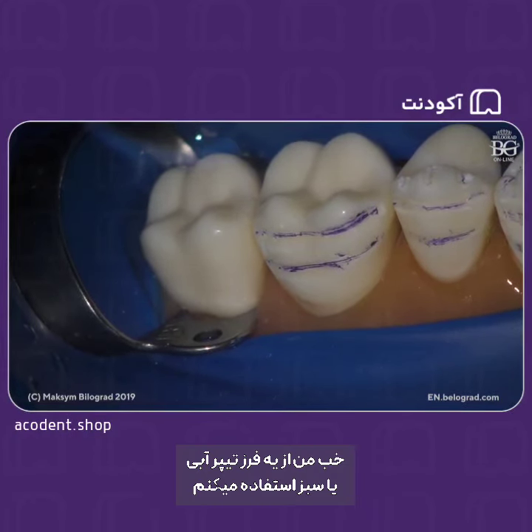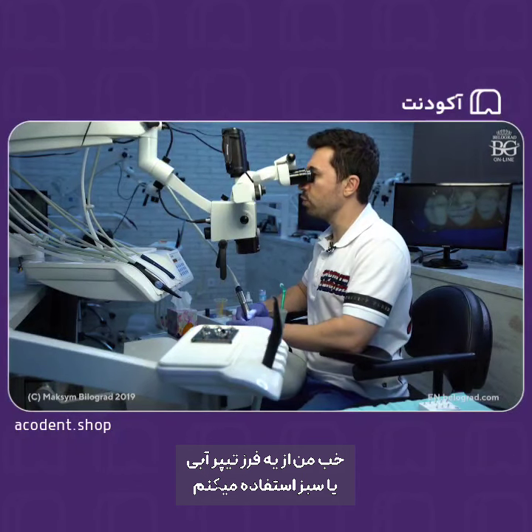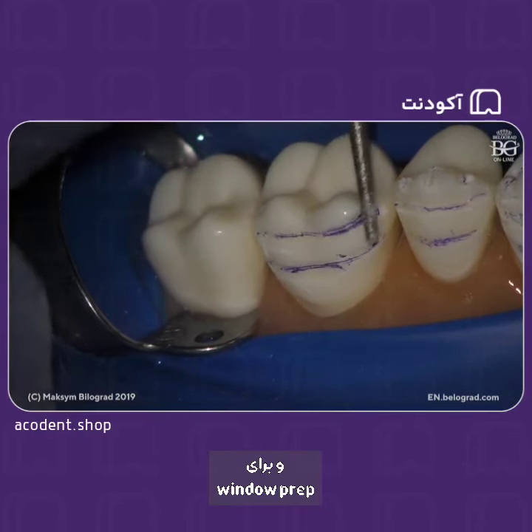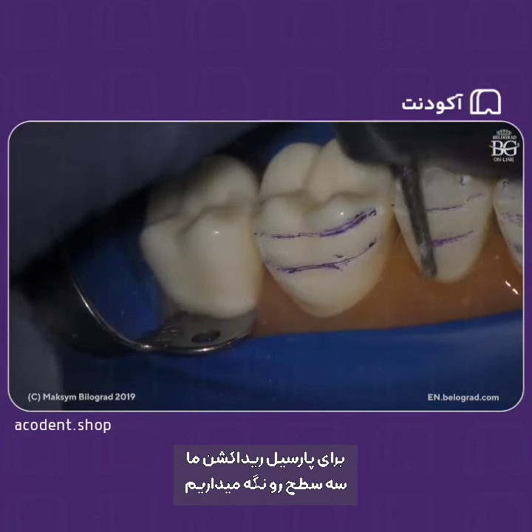So I'm having my depth cutting burr, another burr, the tapered one, this one. This is the blue stripe burr or the green stripe burr, and we can join now these grooves. For window prep and for partial reduction prep, we keep 3 planes.